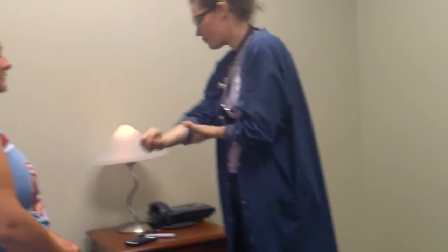No. Okay, that is the Rinne test, and what we're looking for is bone to air conduction, and you're going to have a 2-to-1 ratio on that. You're going to hear it longer in the air. Okay, and then after that, we're going to check out your nose.